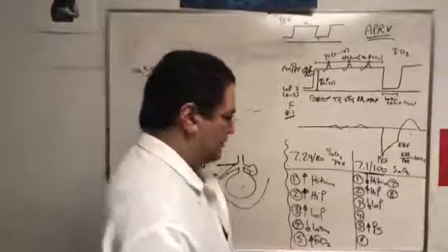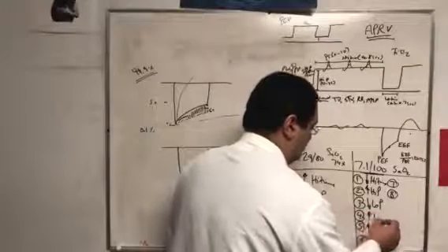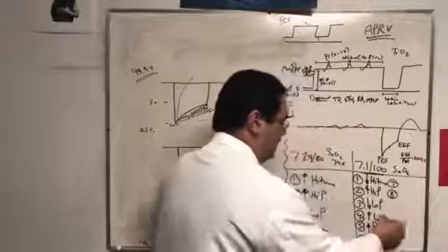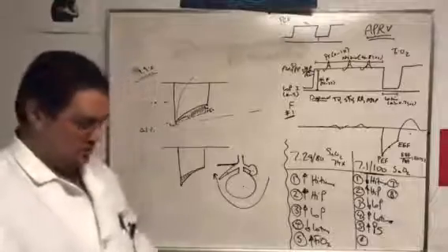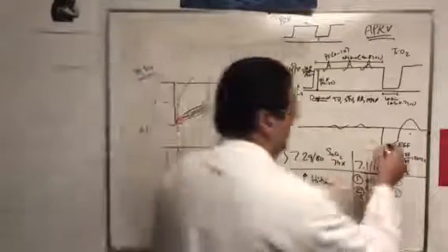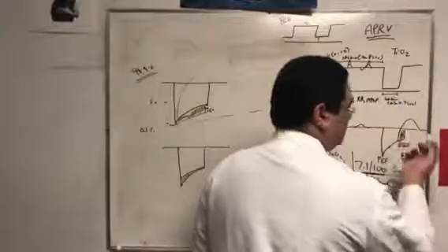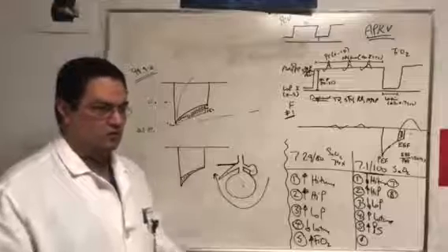What else? I'm going to say, increase or prolong the low time. This is the most guaranteed way to improve the ventilation. But why is it number 4? Because you can see, by going from here to here, this area is additional area under the curve. That's it, there's no debate. You will improve the tidal volume, no question about it.